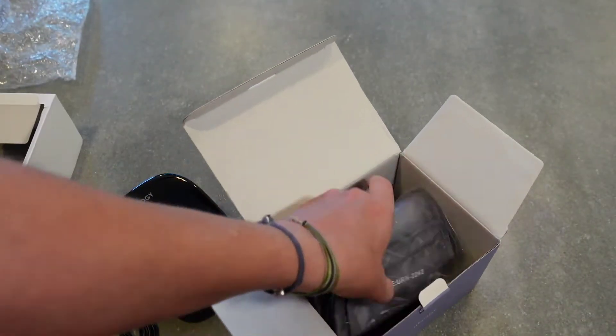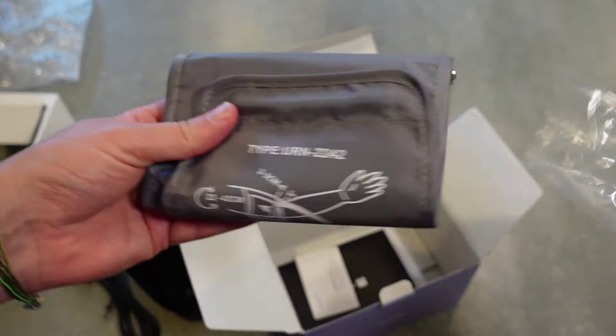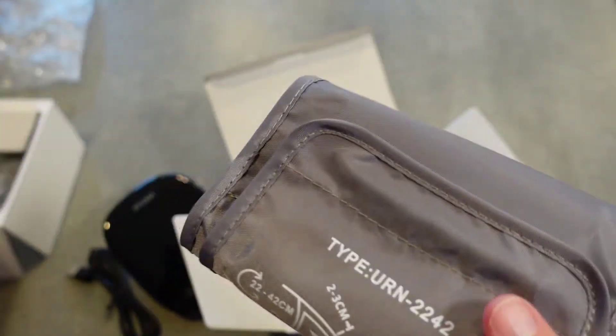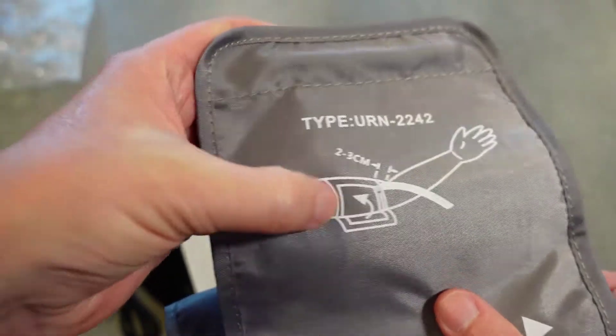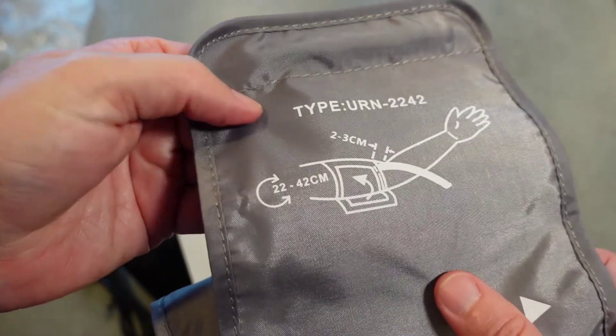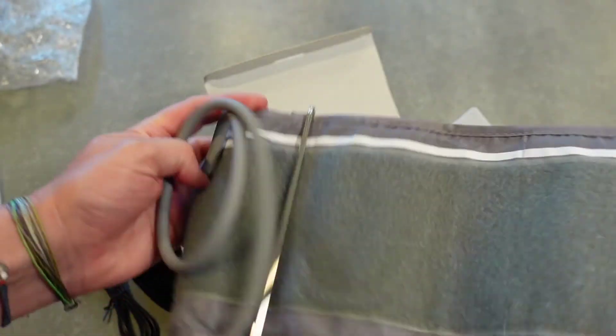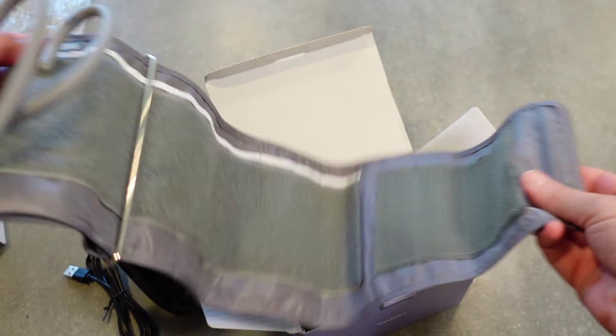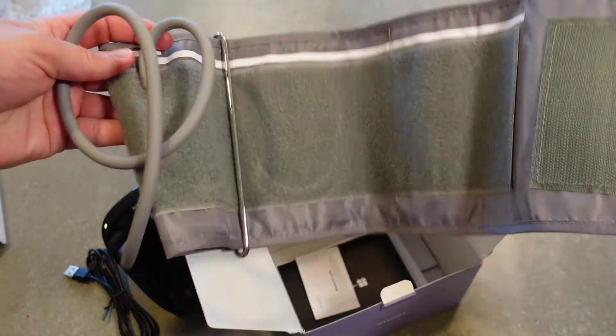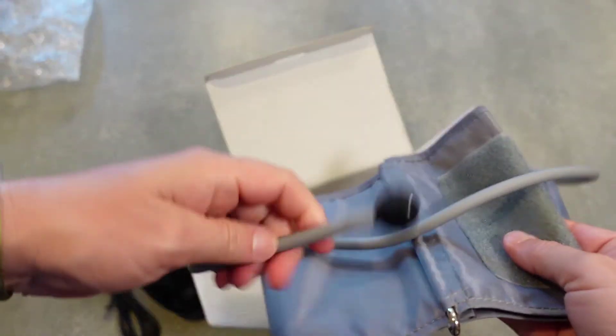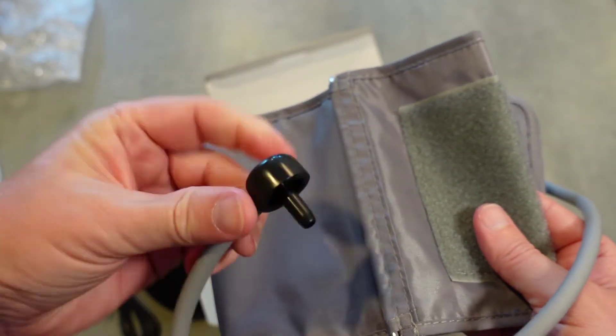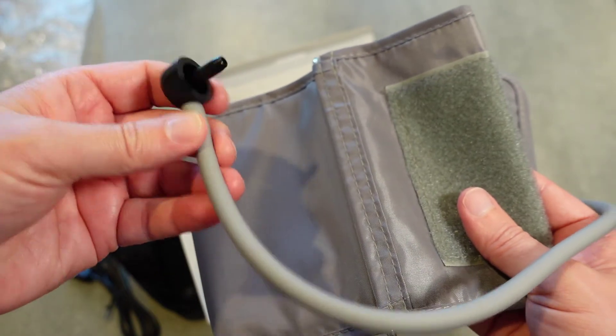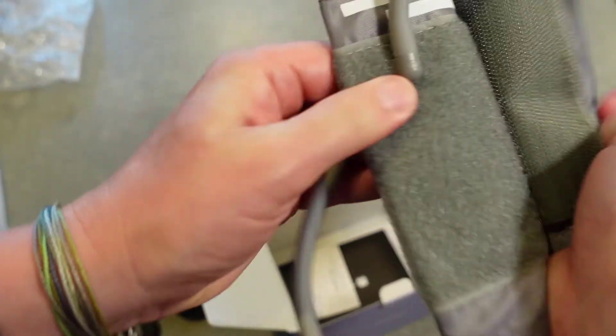And let's see. You've got your, this is your cuff. Got a little diagram showing you the best place to put the cuff right there, right above your elbow. And this does seem to be a rather large cuff to fit different size arms. And then you've got your cord that plugs into the blood pressure monitor. Take those measurements.